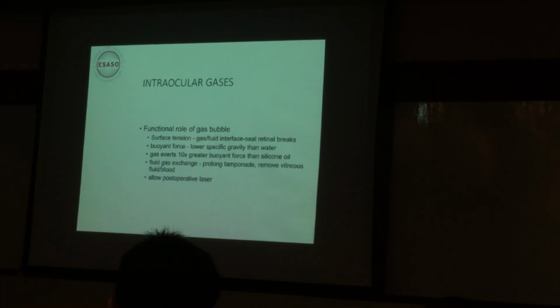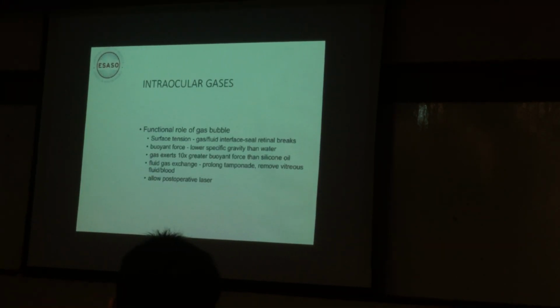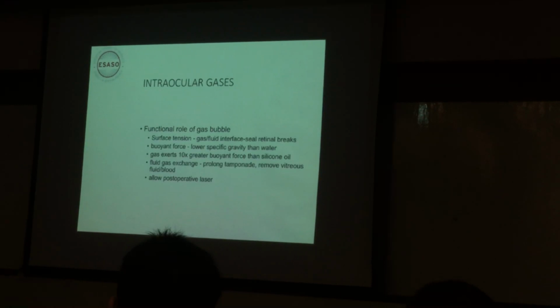And the force of this buoyancy can be measured and compared, and we know that gas exerts a much more buoyant force compared to, say, silicone oil, up to 10 times. You would think that silicone oil, being a viscous fluid, can exert a lot of buoyant force if you place it against the tissue, but actually it doesn't.